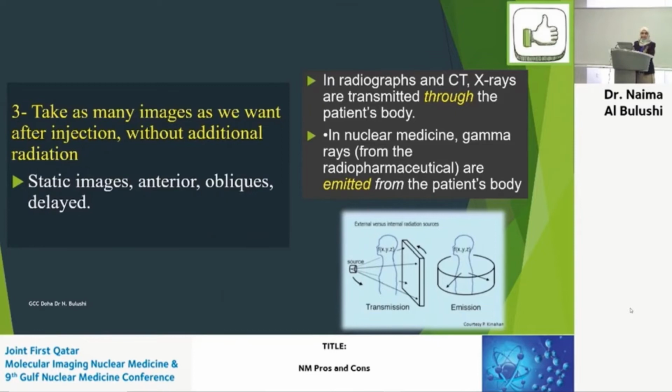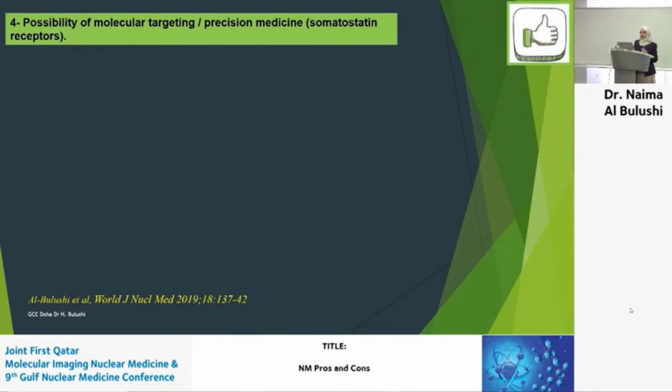Because in radiology, we do a PA chest, and if we want a lateral, we have to have a clear indication. Here, we don't. But just be mindful of the time, because otherwise the technicians will hate you if you have lots and lots of extra images to do, but there is no extra added radiation.